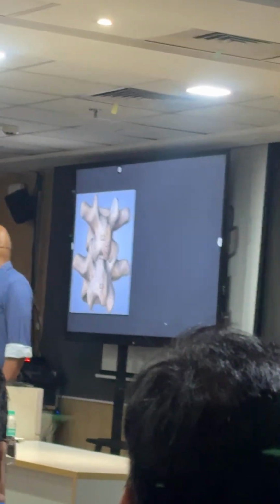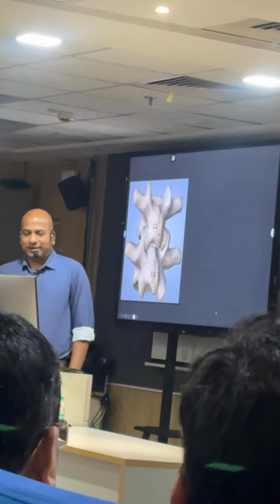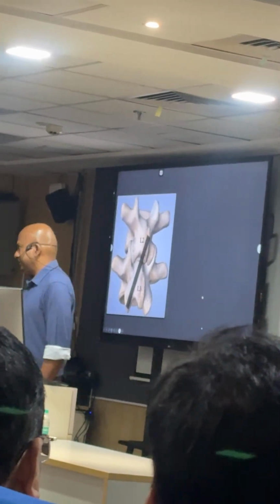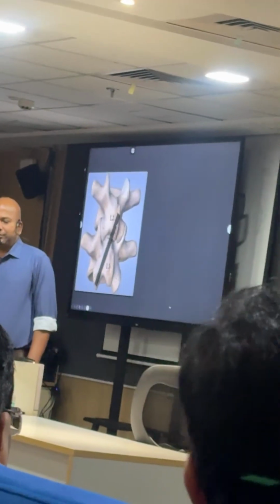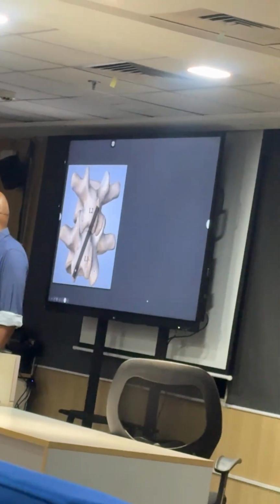Because it's quite dry, it's difficult to make it very simple and easy to understand. So now the cross view. Once you arrive at the articular process view, you are going to rotate the probe like this. When you rotate the probe, it is going to cut two different vertebrae, the spinous process of the cephalad vertebra and the lamina of the lower vertebra. Are you able to understand?